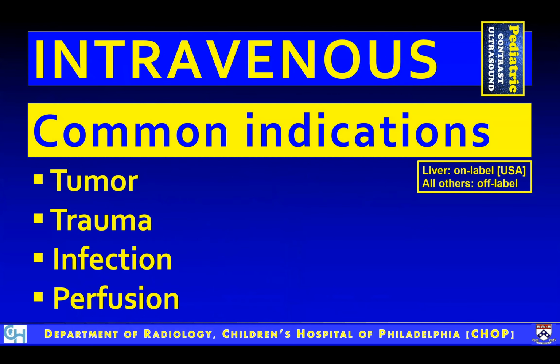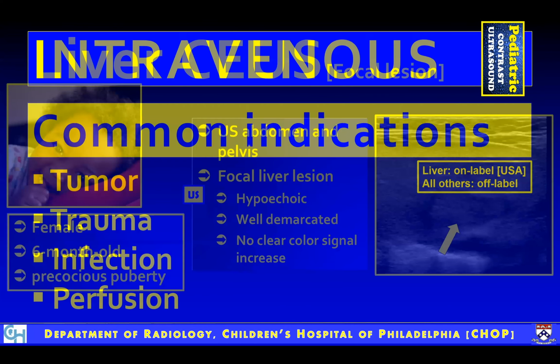Starting with the intravenous application, what are the common indications? Tumor, trauma, infection, and perfusion questions in children. Liver examination is on label. All other examinations are off label.